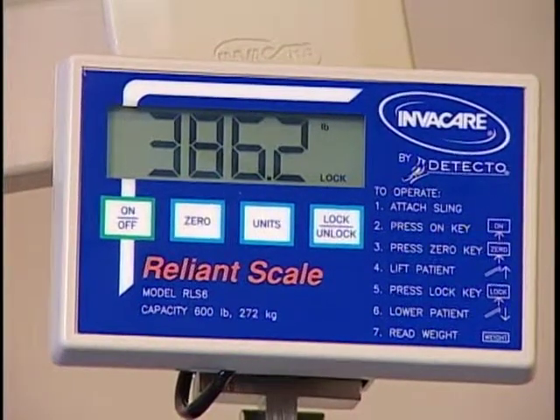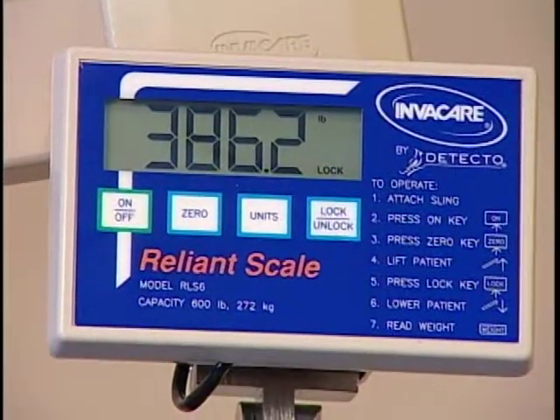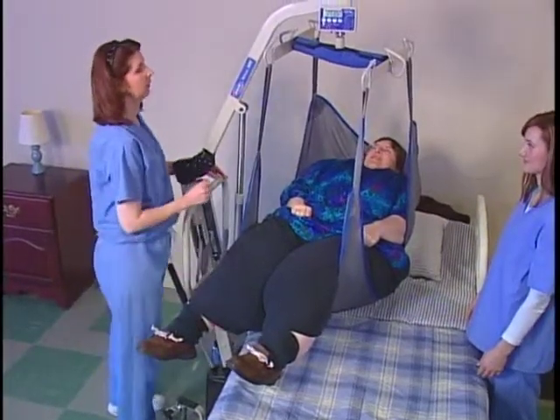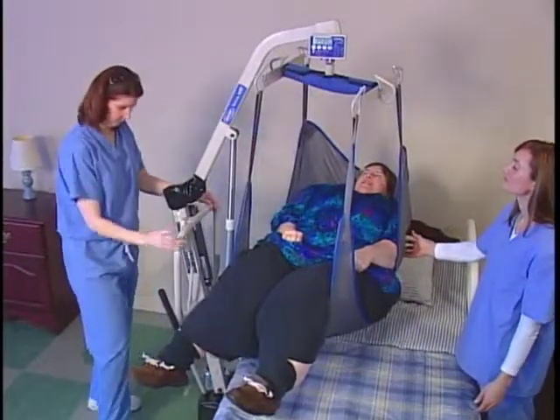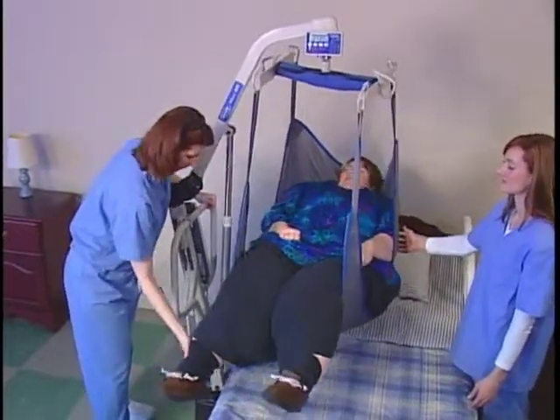The word LOCK will light up in the display window to verify that the weight has been captured. This reading will remain in the scale's memory until you press the LOCK-UNLOCK key to clear it. To conserve battery life, the unit will shut off after two minutes of disuse, but the LOCK reading will remain in memory until you clear it.